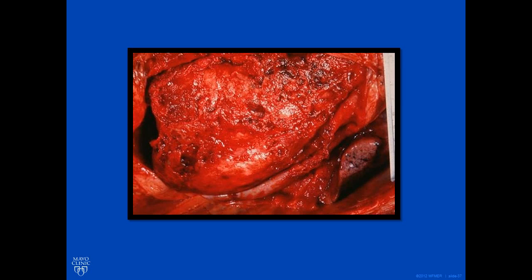What happens in your trial design, and I hope there will be a trial design, what if you go to the FDA and they say then, well, pericardial effusion, we were so incredibly concerned about it, happened 5% or 4% or 2% or whatever it is, even though it didn't kill anybody, they were in hospital for a longer period of time. Suppose the FDA then says, gosh, pericarditis, they're in the hospital, they have a pigtail catheter in, you're trying to decide how to best manage it, it happens 4% of the time or 3% of the time. It's an adverse event. And we're going to use that in your study compared to rivaroxaban or whatever it is that they're comparing it to.